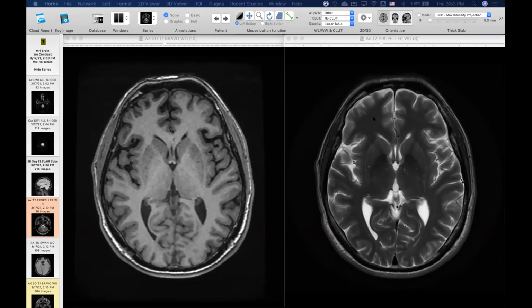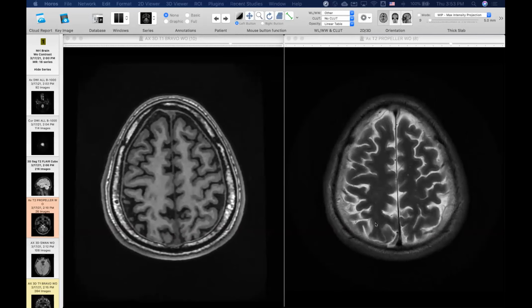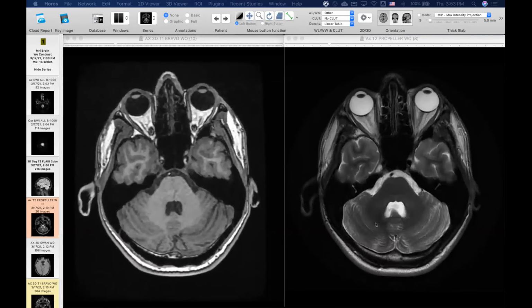And you can see those differences. First of all, white matter now is darker because it has a shorter T2 than gray matter, which has a longer T2. What about the white stuff over here? CSF. That's cerebral spinal fluid, CSF, so free water. So it has a very long T2, so it's pretty bright, right? So yeah, this is a nice T2.